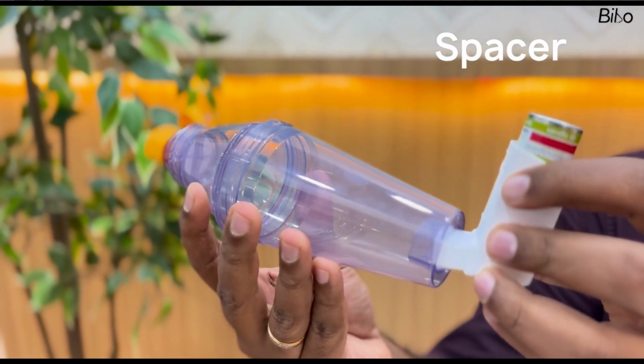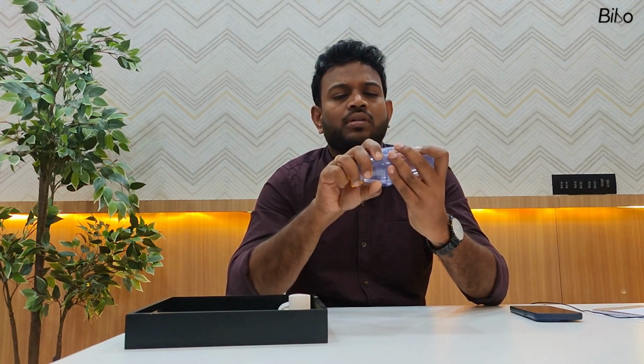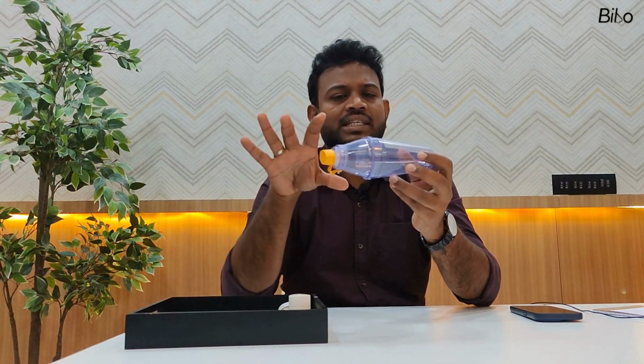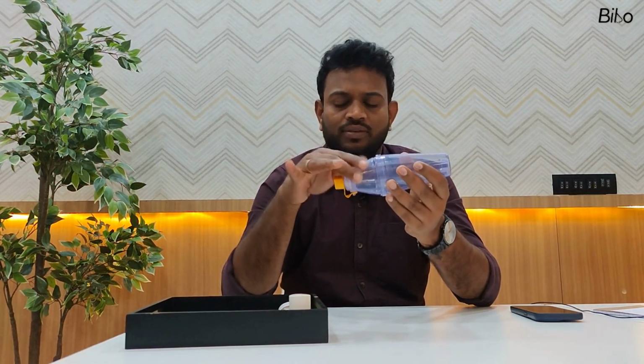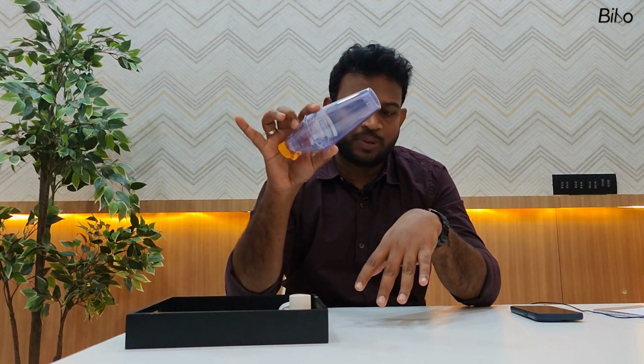This is one type of spacer which is commonly used. So we have to lock this spacer. Few companies have a completely sealed device as well. There is no need of locking or anything. So this is the transparent tube which we call a spacer.